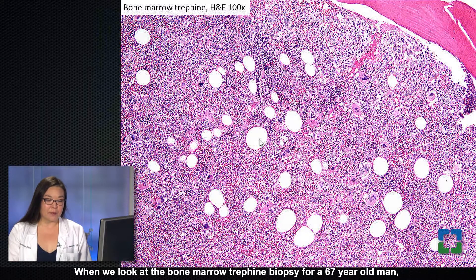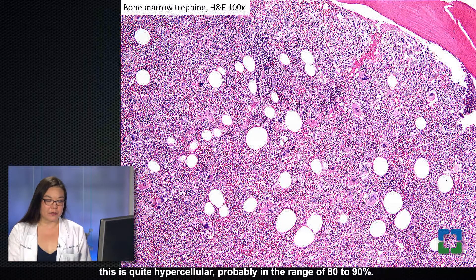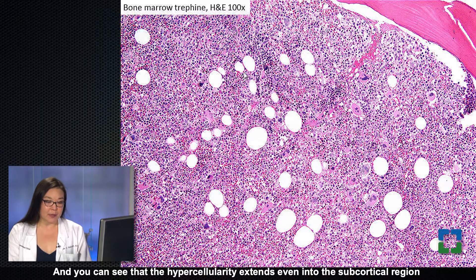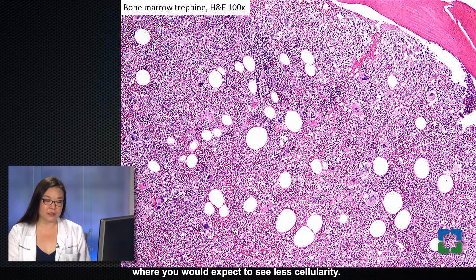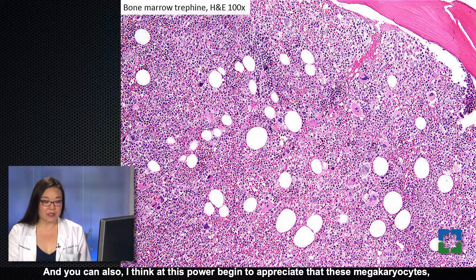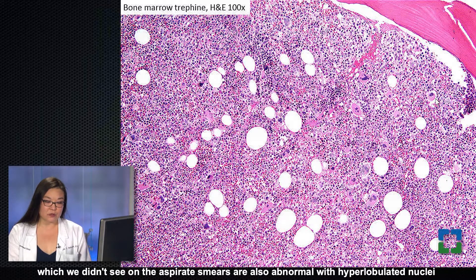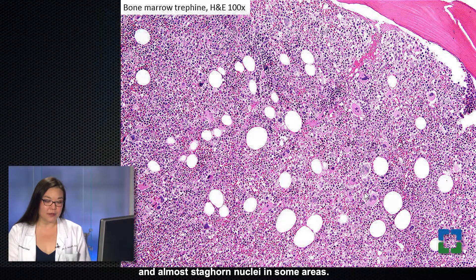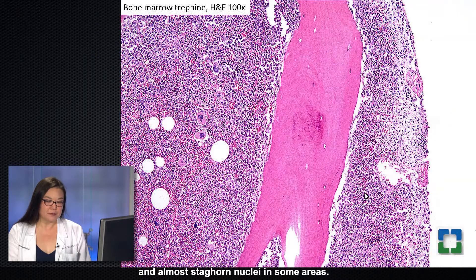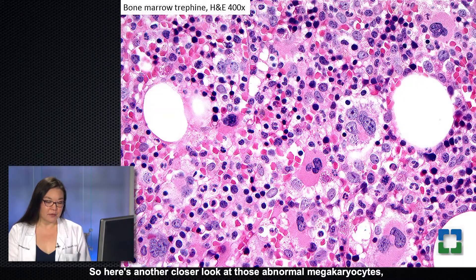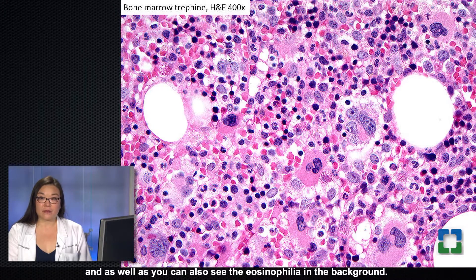When we look at the bone marrow trephine biopsy, for a 67-year-old man this is quite hypercellular, probably in the range of 80 to 90%. The hypercellularity extends even into the subcortical region where you would expect to see less cellularity. At this power, you can begin to appreciate that these megakaryocytes — which we didn't see on the aspirate smears — are also abnormal, with hyperlobulated, almost staghorn nuclei in some areas. Here's another closer look at those abnormal megakaryocytes, and you can also see the eosinophilia in the background.